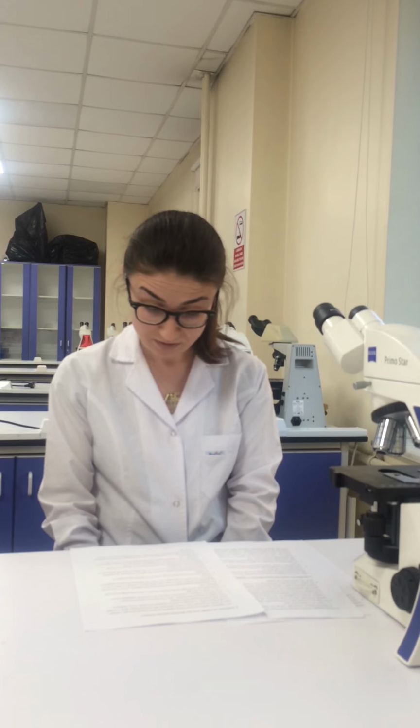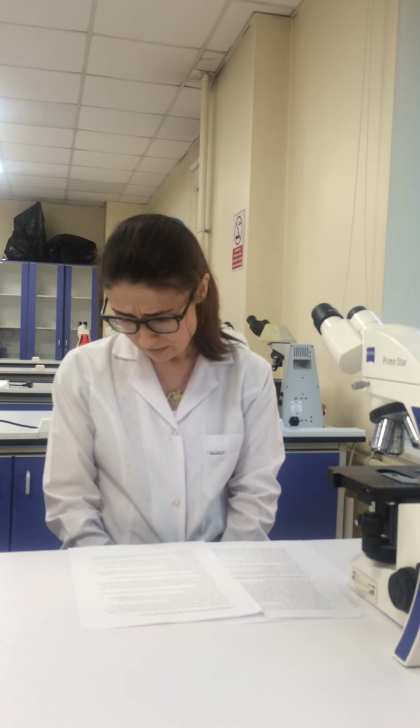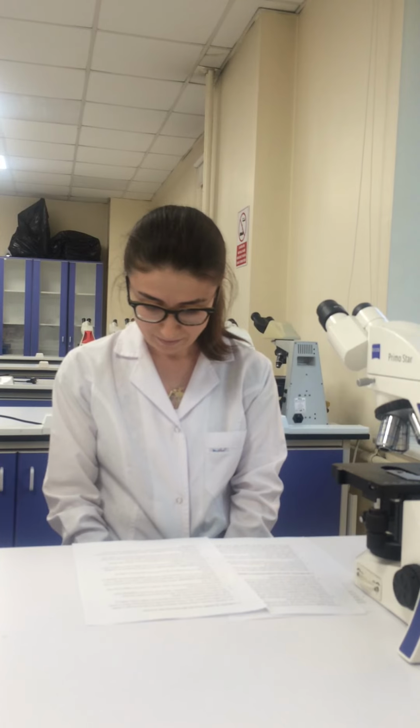The pellet is suspended with repeated pipetting and centrifuged at 700 xg for 6 minutes. This is repeated twice. The DMEM is collected and passed with the suspended cells through a 100 micrometer strainer into a new 50 milliliter conical tube.